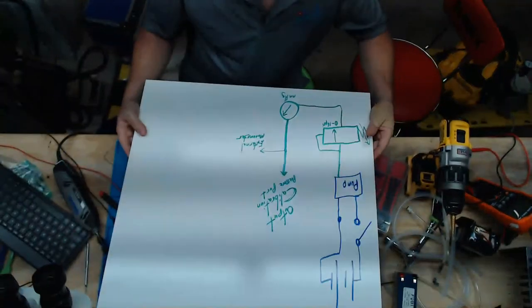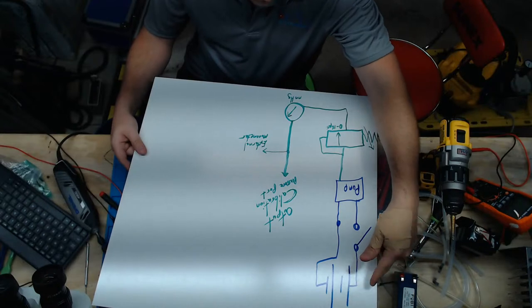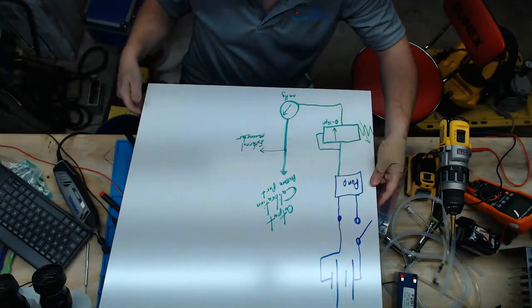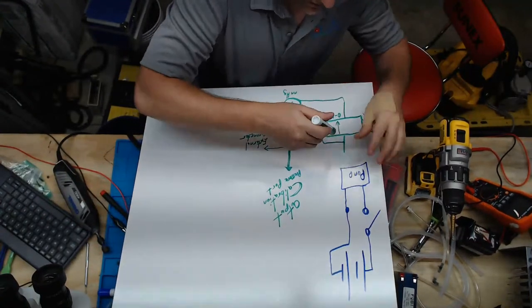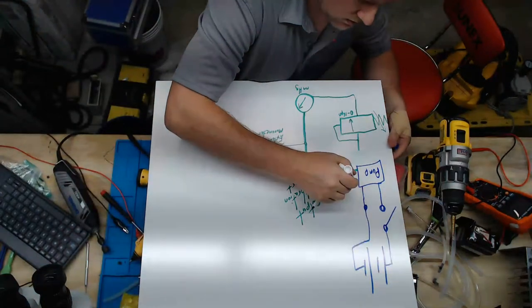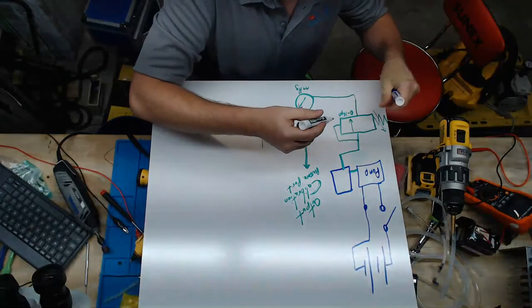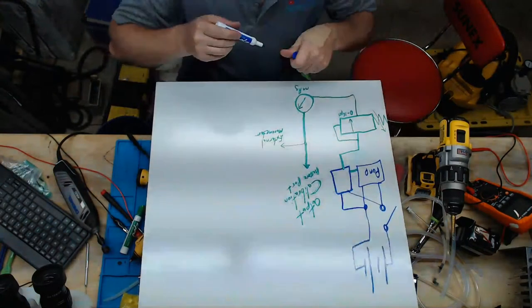All right, guys. Well, this is a very oversimplified version of what I got going on here. So I have the battery power going through the on switch to a pump, which is actually two pumps. And like I said, one pump is boosting the other pump. So it's like a primary. Here, hold on. So actually, this line isn't right here. This pump right here is outputting to a second pump. And both these pumps are running in parallel. So this guy is coming over here and this guy is coming over here. So they're running in parallel.